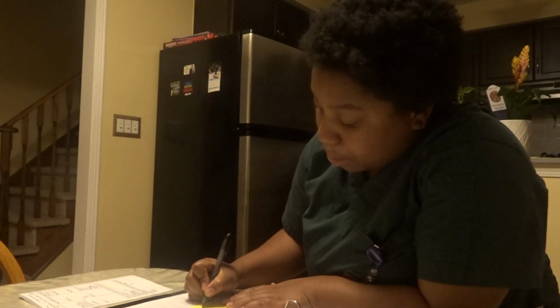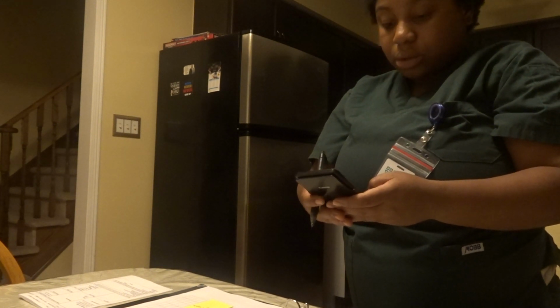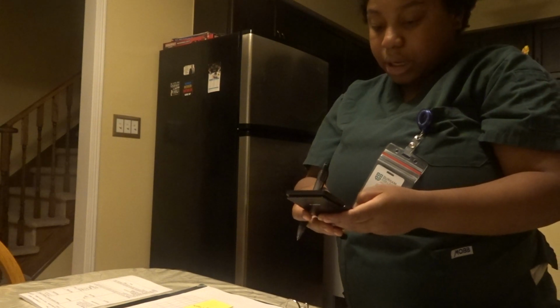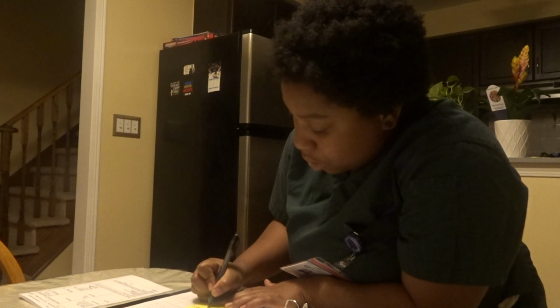So 10 drops per milliliter. So I'll take my calculator, and it says 50 divided by 45 times 10, and that's going to give me 11 drops per minute.